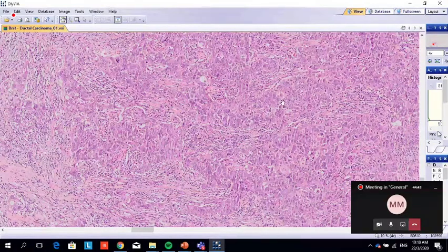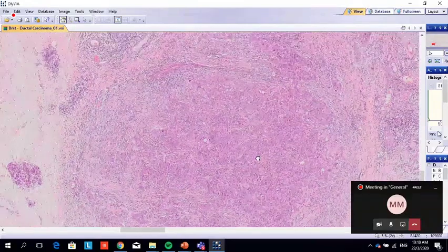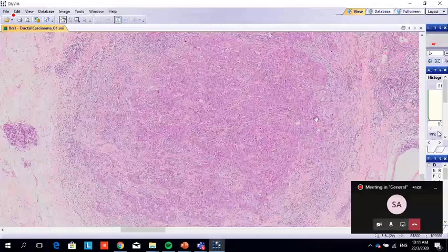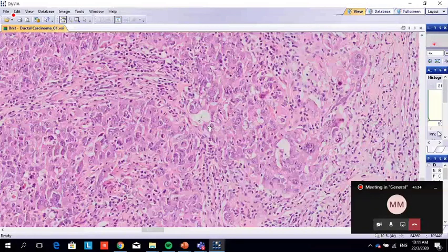So that means you think this tumor is more than 75%? No, I wouldn't say more than 75. What do you think? Say 25 to 50. I think it could be 75. I cannot see a lot, you know. Less than 35, maybe. Maybe this one? Can I see this? No, it's not a gland.